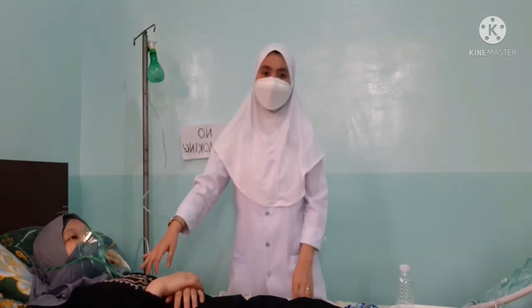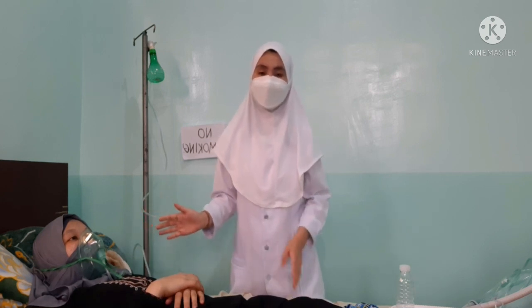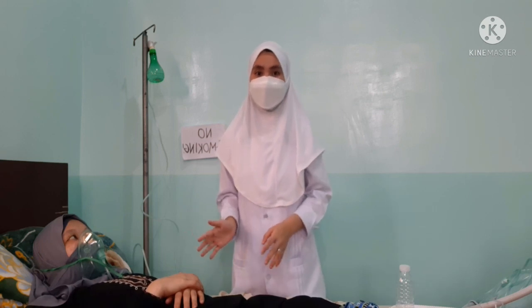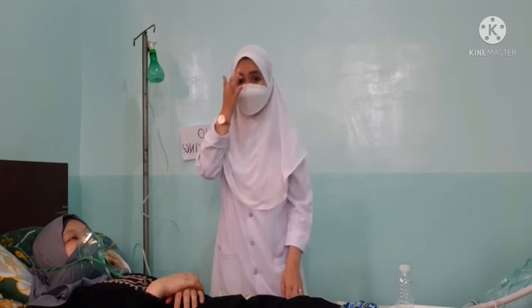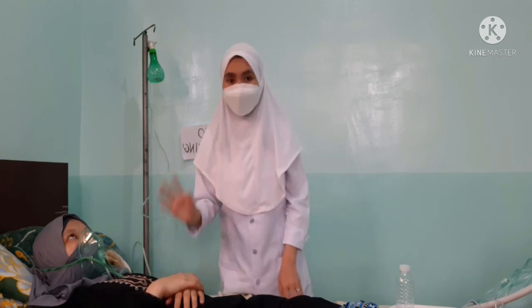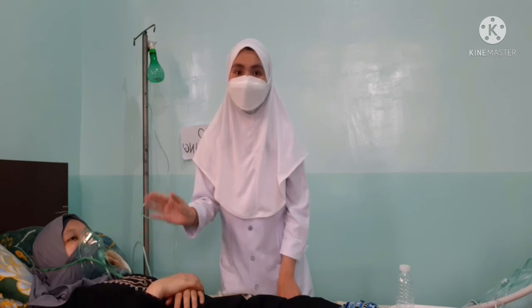Secure the elastic band around the patient's head and adjust the strap so the mask fits securely. The mask should be comfortable but snug for the patient. If the reservoir bag is attached, the oxygen flow must be at the right level. Here we have an oxygen mask with a reservoir bag.